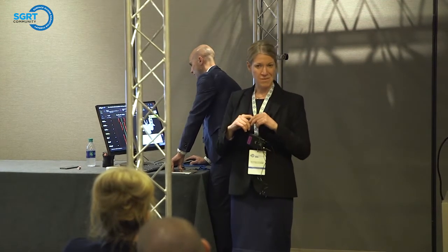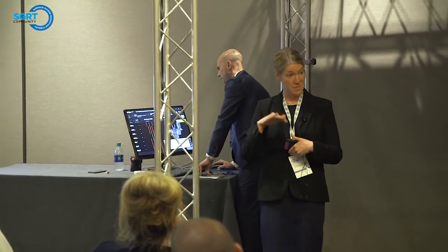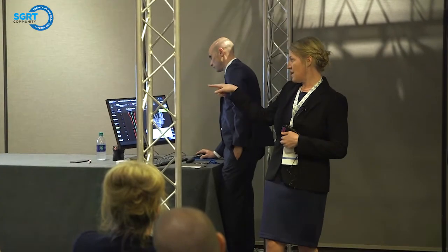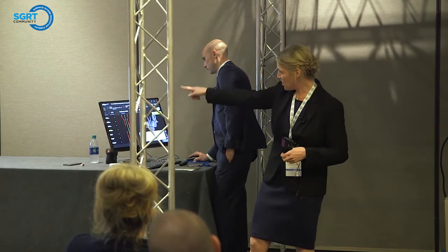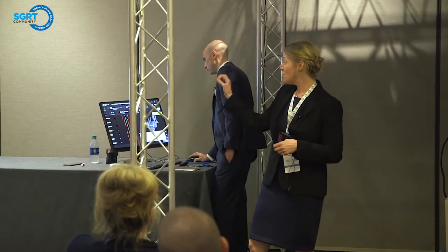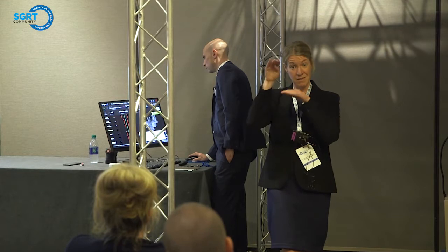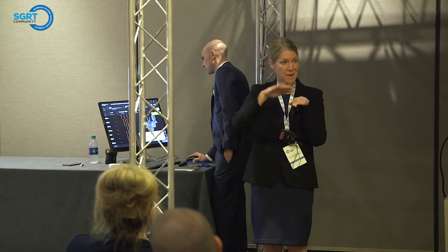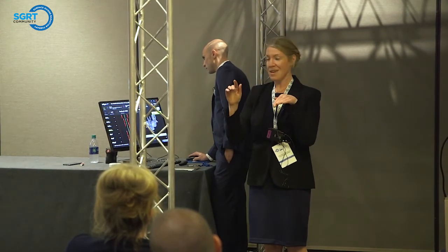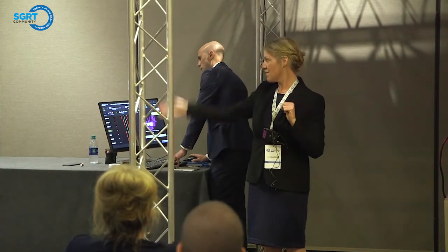Okay, so we're moving the trace down because his isocenter is a little superior, so there's not a lot of breathing motion there. So he just reselected the trace to be closer to the diaphragm where there's the most amount of movement. So now that we see the 30 images, the system actually chooses the image at max exhale. If you see the one at the bottom that's white, the system chooses that one by default. But now I can choose a reference image in the middle of the cycle. So if I have one right in the middle and select that and accept, that will take an average of that patient breathing. And then when I start monitoring, I'll see the deltas, hopefully equally on both sides of zero.